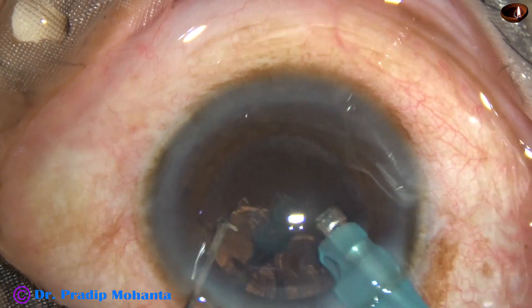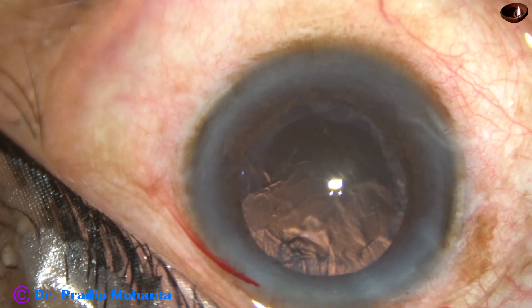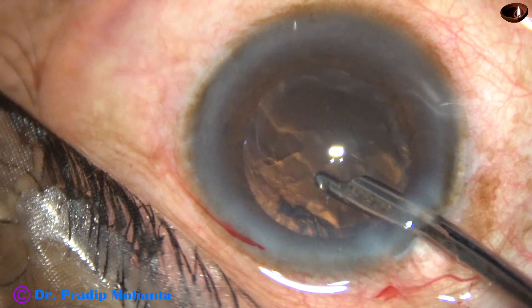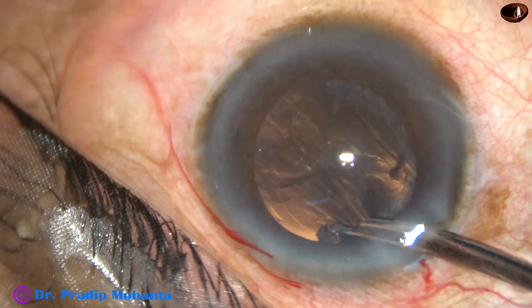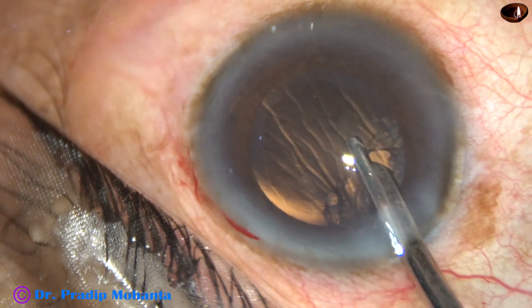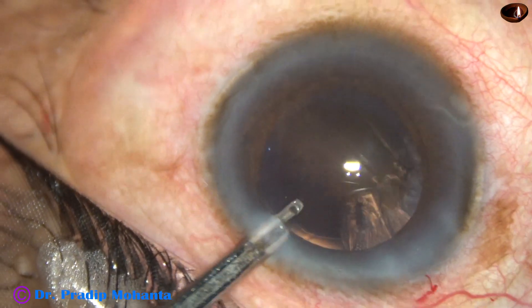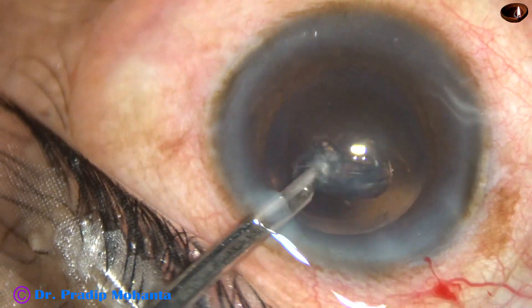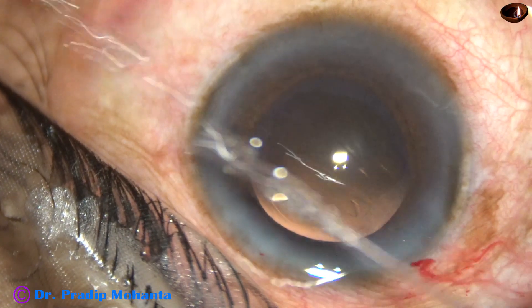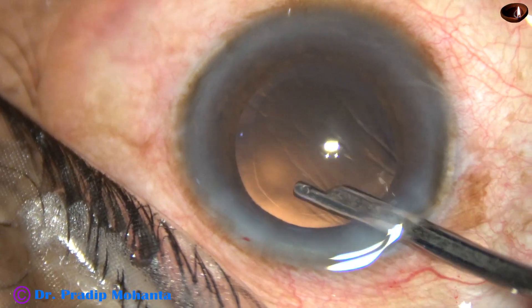Nucleus and epinucleus have been managed. We can see that there is some cortical matter superiorly. Inferiorly, from one o'clock to six o'clock, there is no lens matter. I am going to use a 23-gauge Simcoe in this case because I have made only one side port. I am going through the side port now to remove the sub-incisional cortex, and it is done. Cortical clean-up has been done. There are some cells sticking to the posterior capsule that have to be polished — a little bit of polishing is being done with the Simcoe itself.